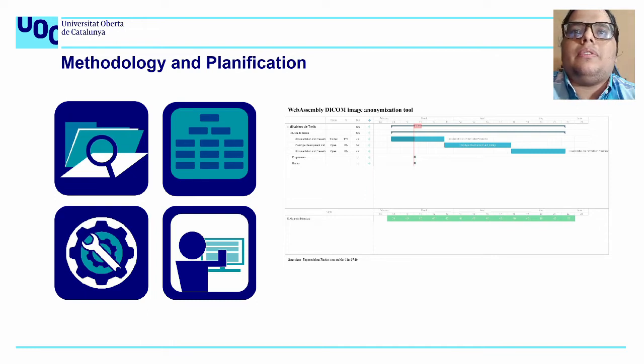The next process is constructing the data that will be needed. After that, the prototype phase is where the first prototype of the application is developed and is tested to verify if the initial idea is valid. After that, the final process is when the final user or a select group of users try the application and give feedback.